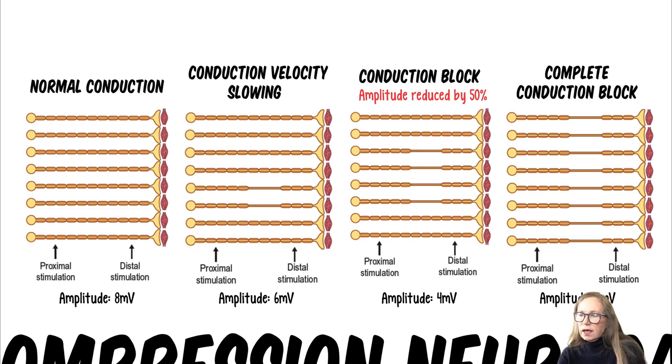I'd just like to say that what we're talking about is demyelination process that surgeons can help with, and that is when it localizes to a known area of nerve compression. If the patient has a systemic demyelinating neuropathy, then we can't treat that with surgery. And we will see patients with both.